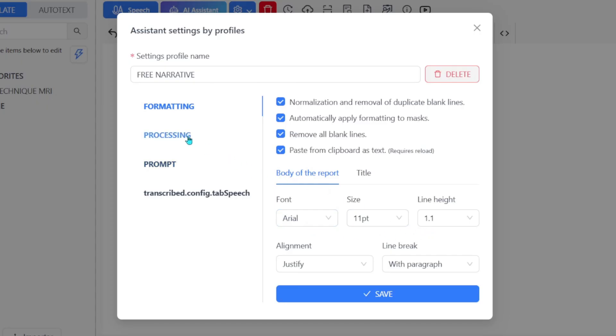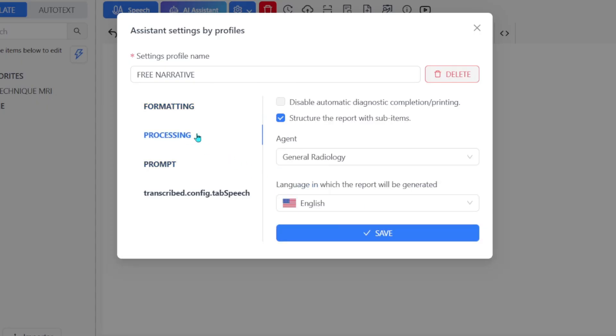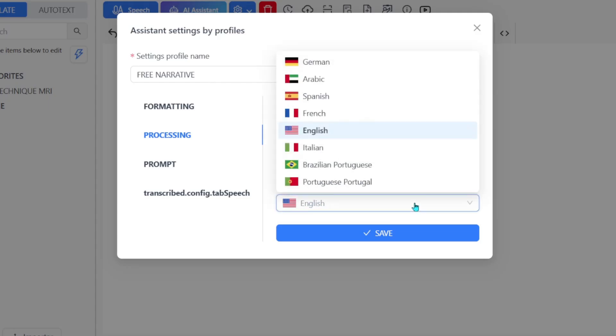In the Processing tab, you can choose to disable impressions and select the structured report format. It is also very important to choose the language in which the report will be generated.